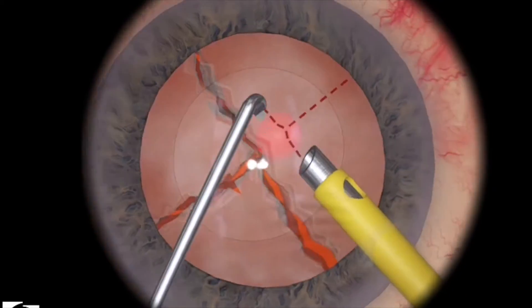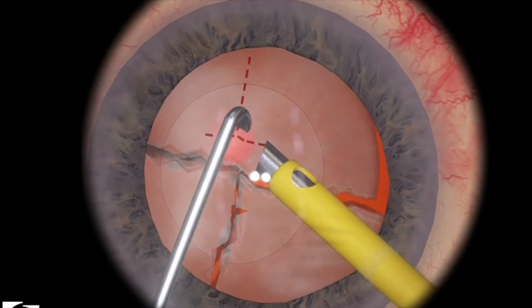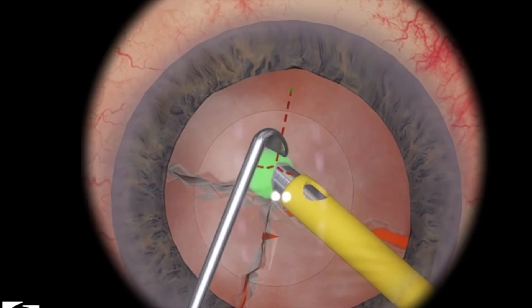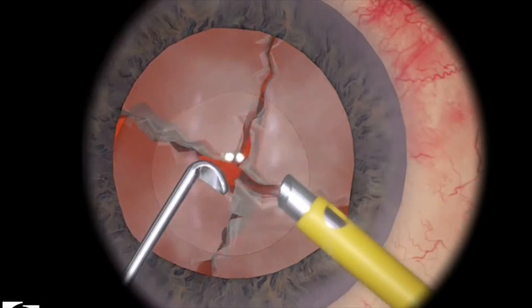I'm just turning and spinning the lens a little bit. Same thing — bury it deep, bring your chopper under, and then crack successfully.